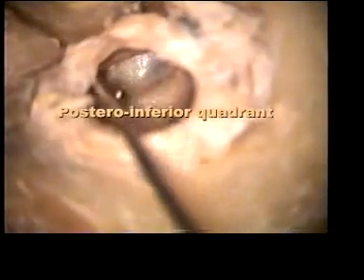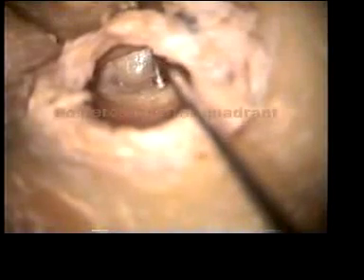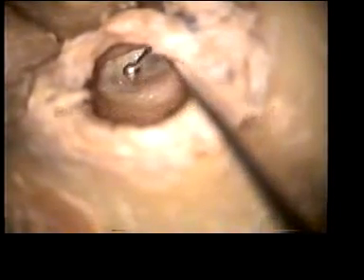Exercise number one: grommet or ventilation tube insertion. First of all, we should identify the landmarks. The tympanic membrane can be divided into four quadrants: antero-inferior, postero-inferior, antero-superior, and posterior superior.